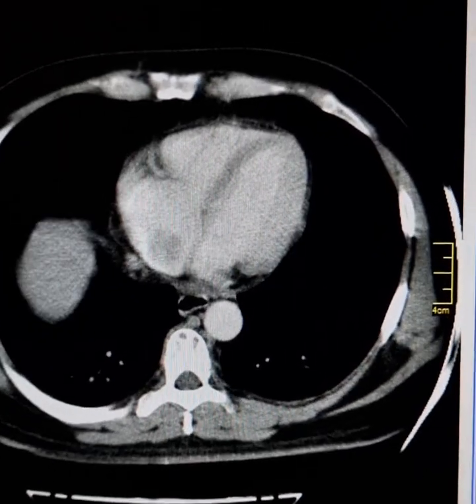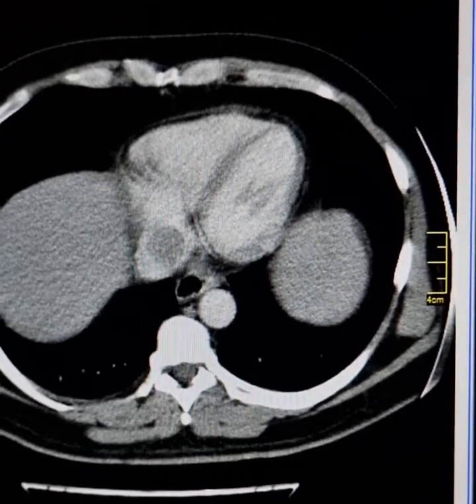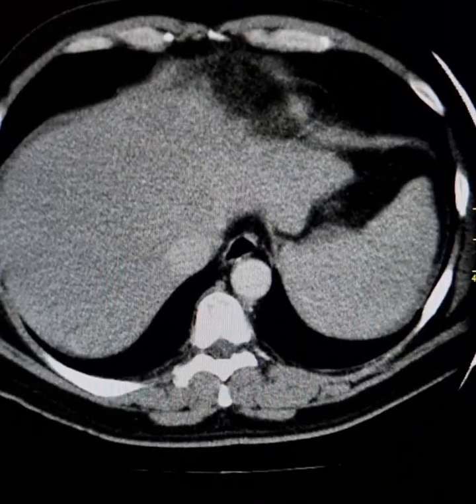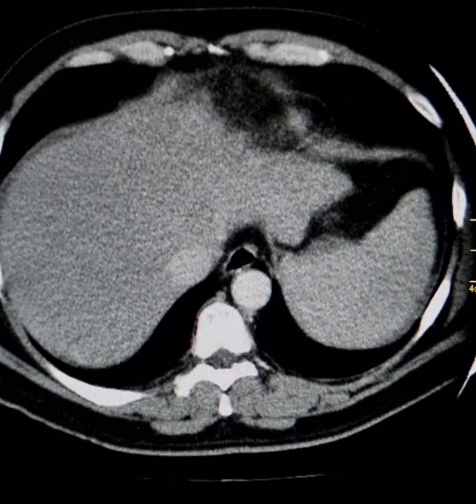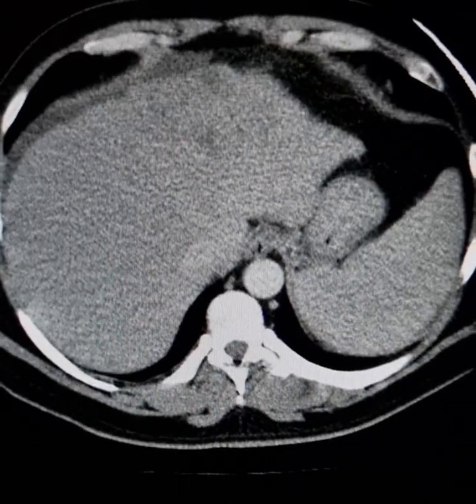This is a contrast CT scan of a 47-year-old male. He is a known case of hepatitis C.